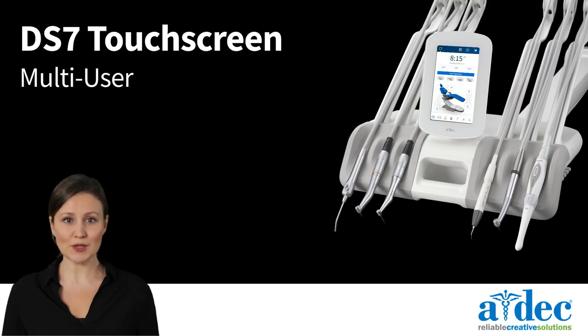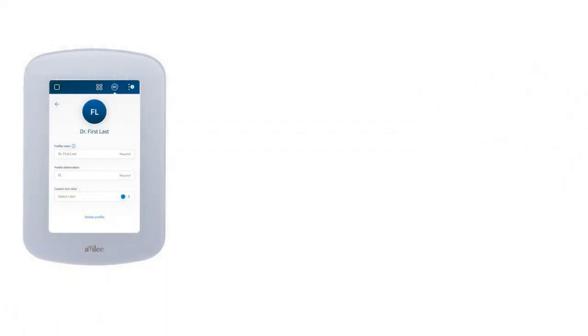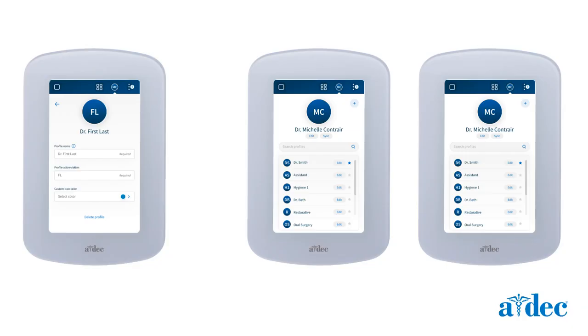In this video, we will discuss using the multi-user function on the DS7 touchscreen. Multi-user allows each practitioner to configure their custom settings in one place. Settings will seamlessly be shared with other registered DS7s in the clinic. Note, to use multi-user, the DS7 needs to be registered using the A-dec Plus app, and the chair must be equipped with a universal chair board.